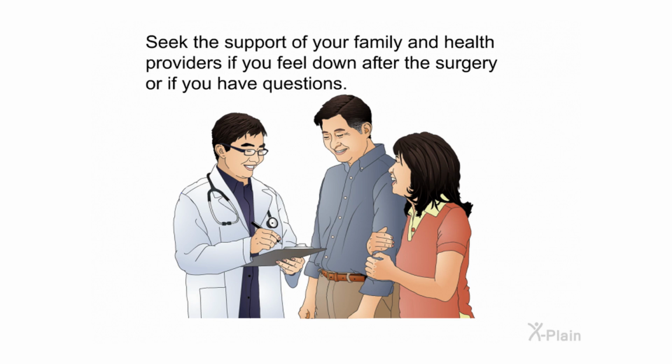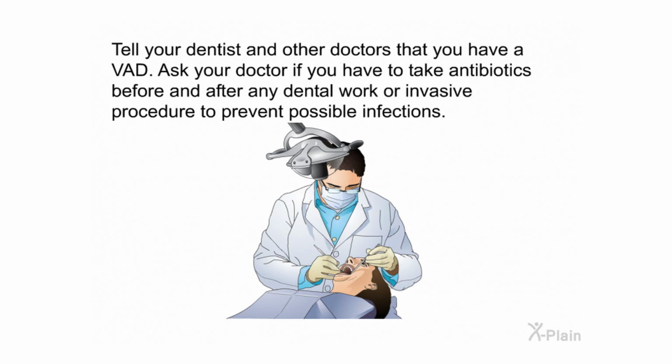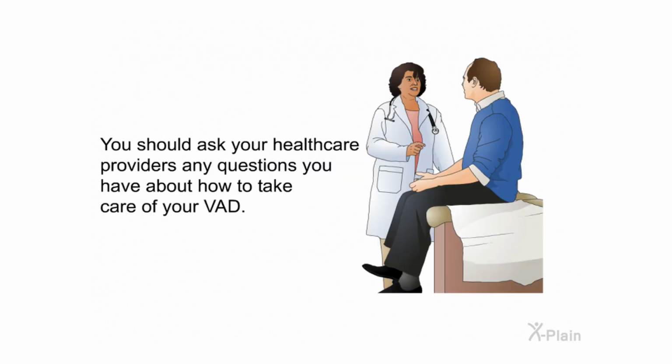Seek the support of your family and health providers if you feel down after the surgery or if you have questions. Tell your dentist and other doctors that you have a VAD. Ask your doctor if you have to take antibiotics before and after any dental work or invasive procedure to prevent possible infections. You should ask your healthcare providers any questions you have about how to take care of your VAD.